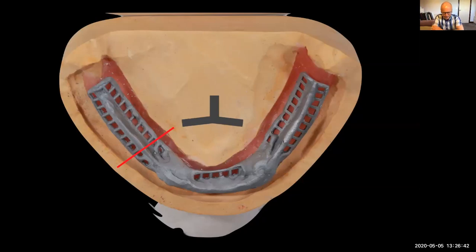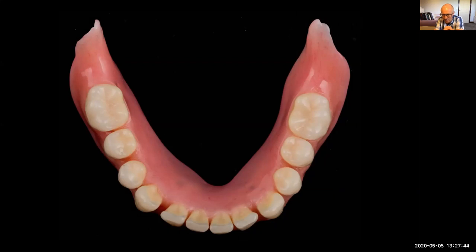Now, the other thing is that I really hate dentures that break. This is a massive issue. We can make dentures that are dead comfortable, but if we make a complete lower on 2 implants that is just plastic, just acrylic, they can snap. So what we do is we reinforce these dentures with a cage, or we can sometimes use a plate if we've got less space. So a cage. Now look at the cross section of this. This is something that John Wibberley taught me years ago, that the back edge here should have a T-shaped cross section, which is like a girder. It's like an RSJ support, and it stops the whole thing from twisting. So it's not just a piece of coat hanger wire in there. It's really, really solid. And then the denture encases that metalwork.